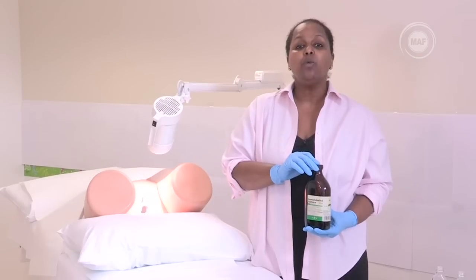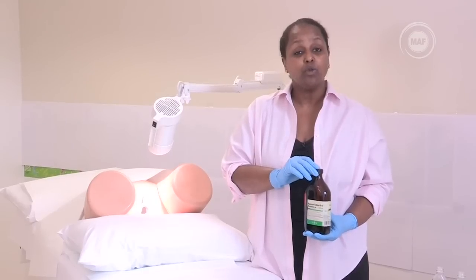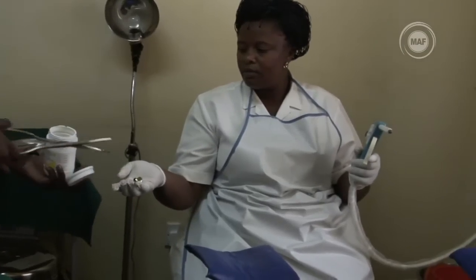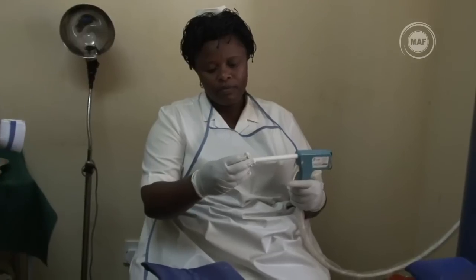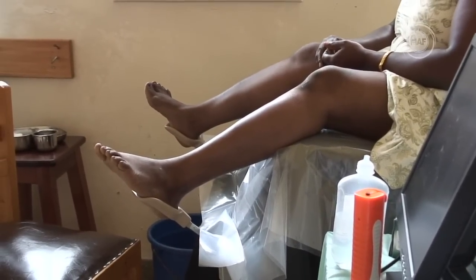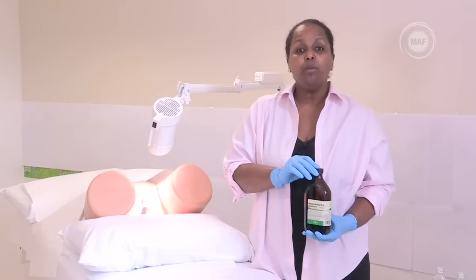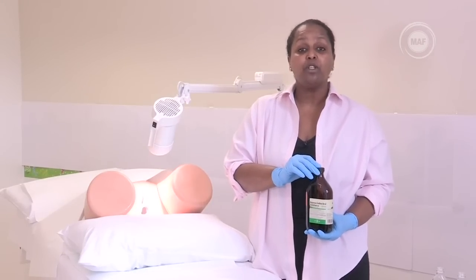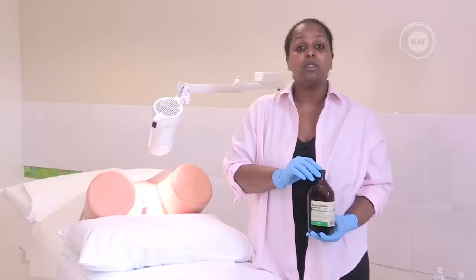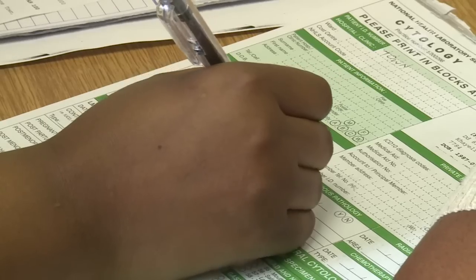What should we do after the examination? Depending on what you have observed during VIA or VILI, you may need to refer the woman for further investigation or treatment. A woman with a positive lesion should be treated that day with cryotherapy if possible, and it may also be necessary to carry out further investigations such as colposcopy and biopsy. A woman with a lesion suspicious for cancer should be referred to the closest referral site for diagnosis and treatment. Remember, it is important to reassure the patient and inform them about further treatment or side effects following the procedure.